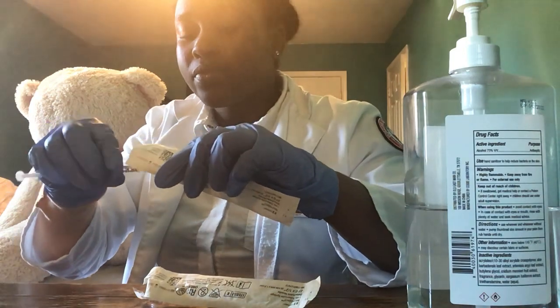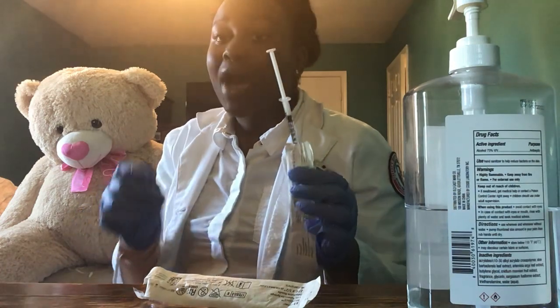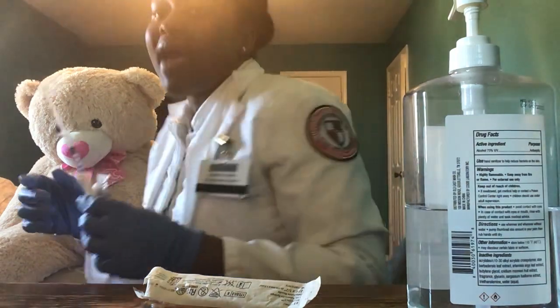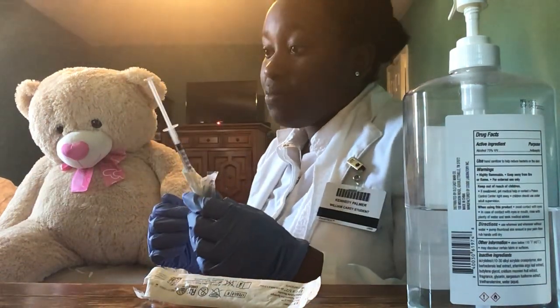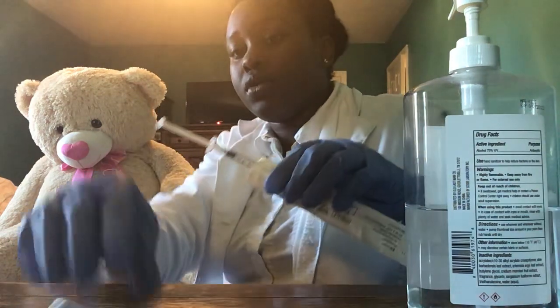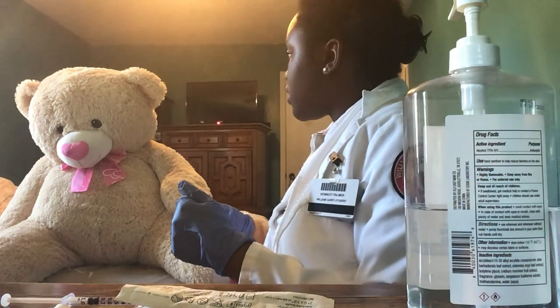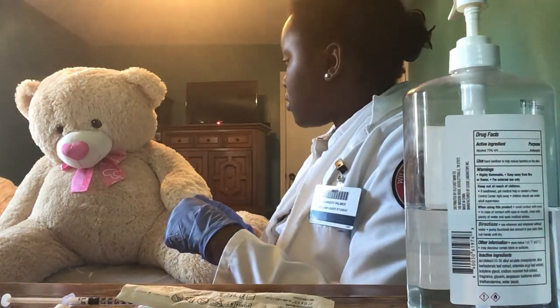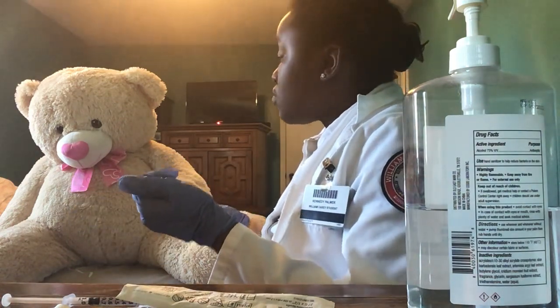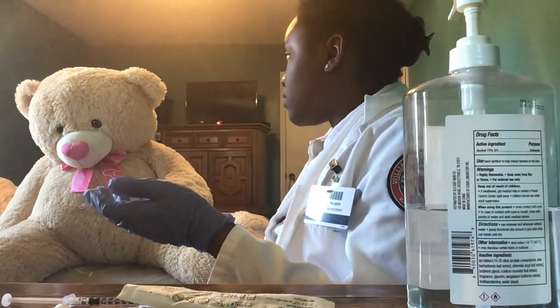Okay. I have my needle here. I'm going to take it into the patient's room with me. However, I would label the medication first because I am outside of the patient's room preparing it. And now that I'm at the patient's bedside, I'm just going to verify the medication administration along with the physician's orders again. Okay. And so, ma'am, I will be administering this medication in your deltoid muscle. You could have it delivered in the deltoid, in the vastus lateralis, or the ventral gluteal.